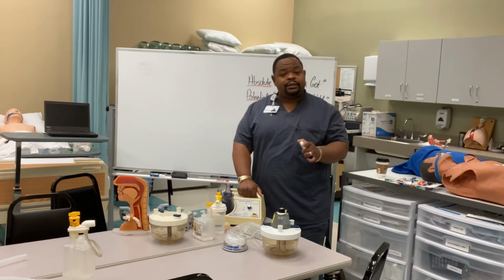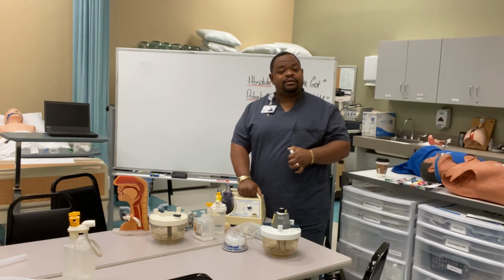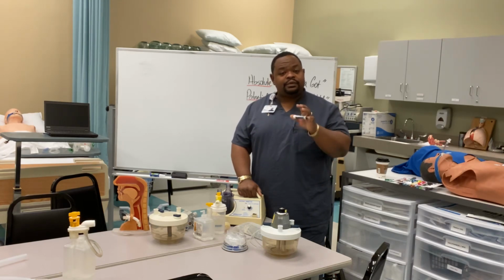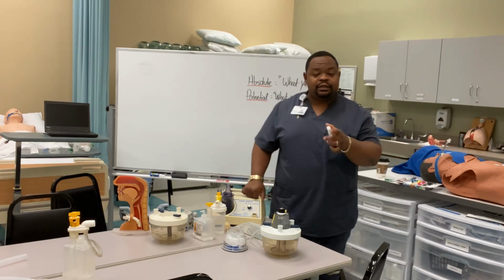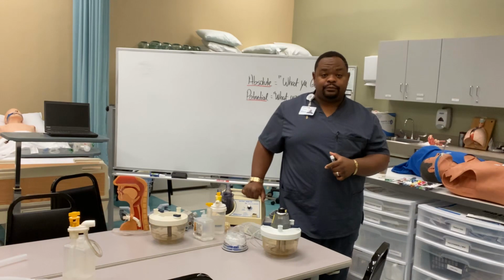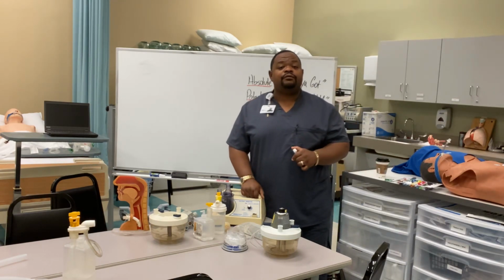So it's very important as a therapist that you know your patient. Assessment, assessment, assessment. Know what kind of patient you're dealing with. Know their history and make the proper decisions. This is the Humidity and Aerosol Lab. There are going to be some other devices in your book that we don't have at the lab, but you can look at those, study those as well, okay? And I will see you for the live lecture.